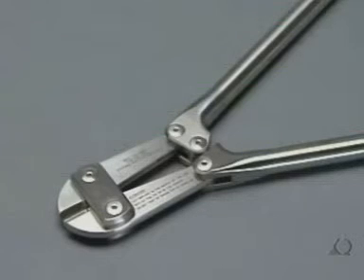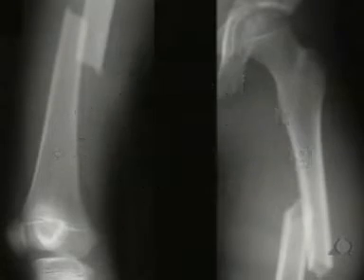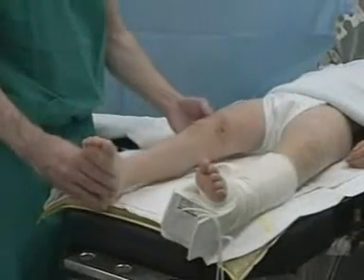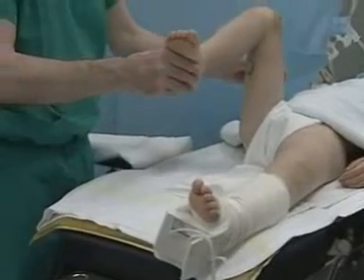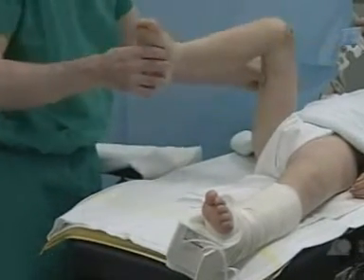It must be noted that with the standard bolt cutter, the nail has to be cut outside the wound so as not to damage the soft tissue. The surgical technique is demonstrated with the example of a femoral shaft fracture using the standard ascending technique. For variations, the surgical technique brochure is available. Preoperative rotation testing on the uninjured leg helps plan the correct rotational adjustment of the fracture before the nails are placed.